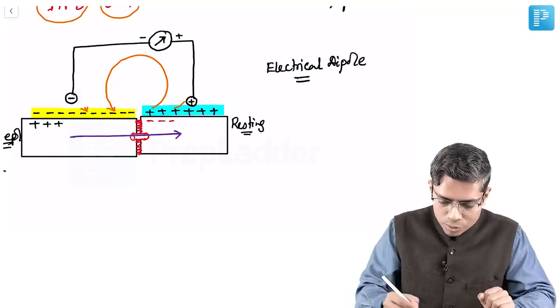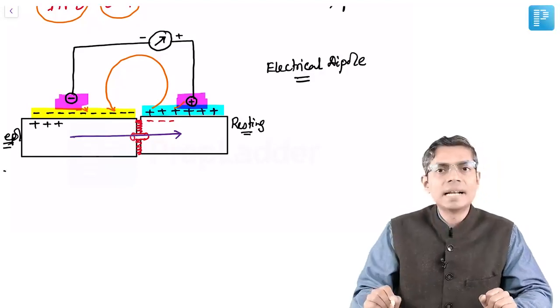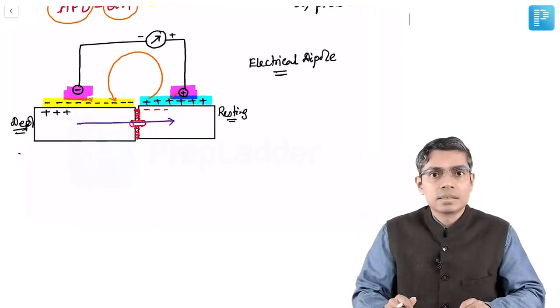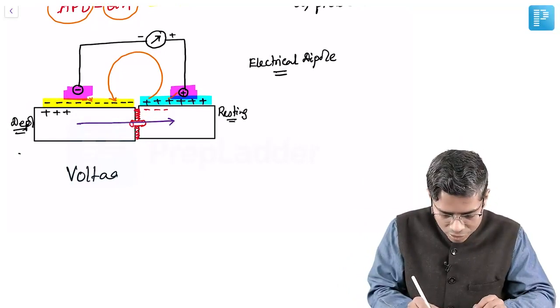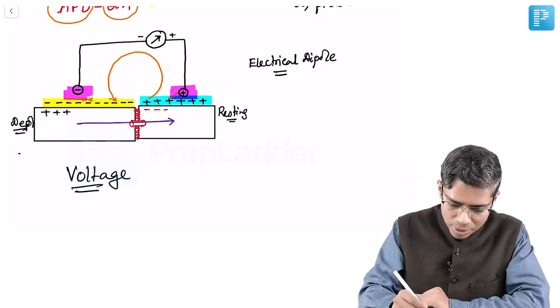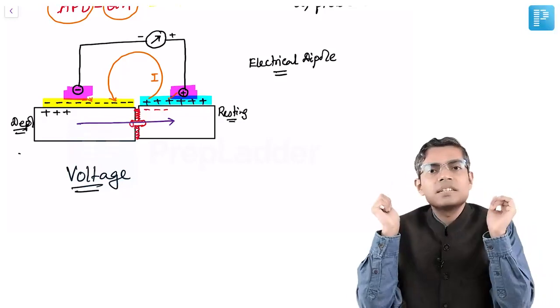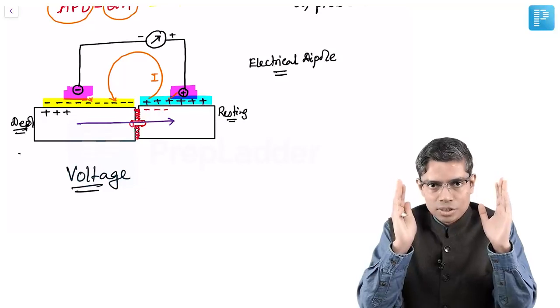The voltmeter is going to measure the potential difference between these two ends, positive and negative. This potential difference is nothing but recording of voltage. So whenever there is flow of tiny current on the surface of this myocardium, the voltmeter is going to record the potential difference between these 2 points, and this potential difference is nothing but voltage.